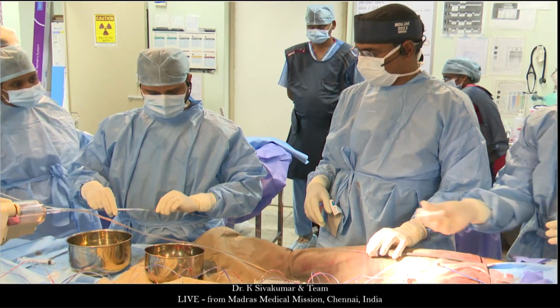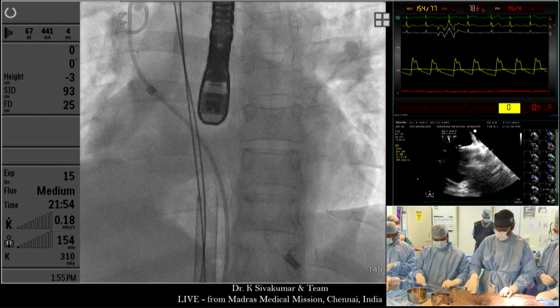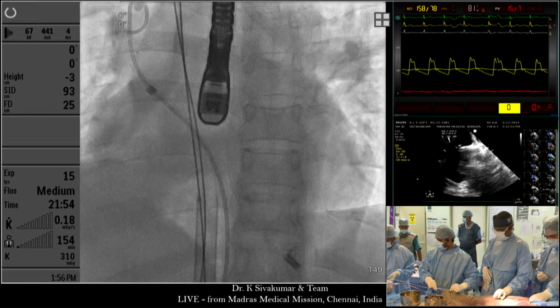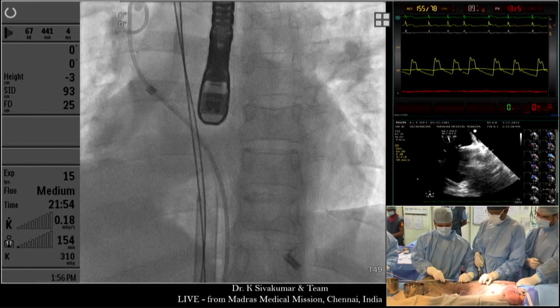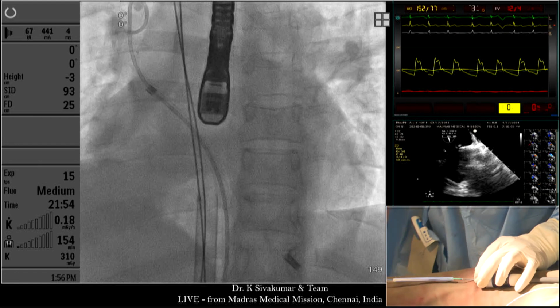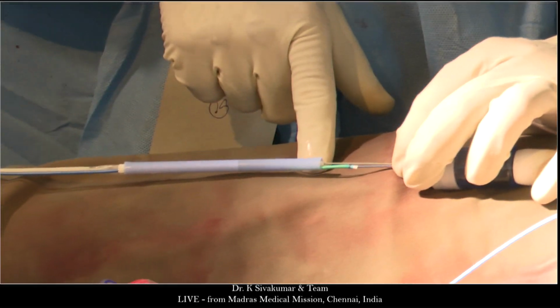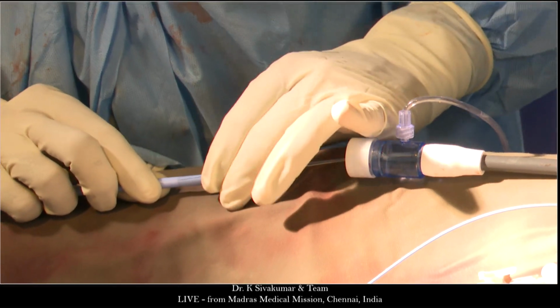Okay, surgery. Obviously, there's still the majority in the world. They use surgical repair of sinus venosus ASDs. Hopefully, this case and the case that Ahmed and I will do on Friday or Saturday, Ahmed? Okay, keep both wires. Friday, we will teach some of you the transcatheter technique, tips and tricks to start a program.